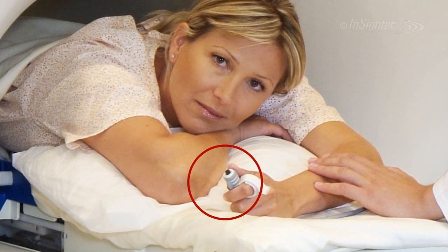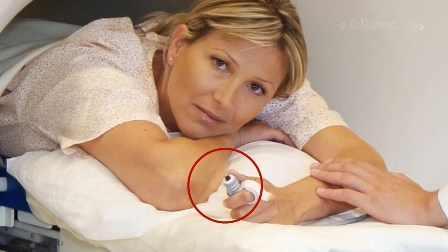The patient can immediately stop treatment at any time using a handheld stop sonication button.